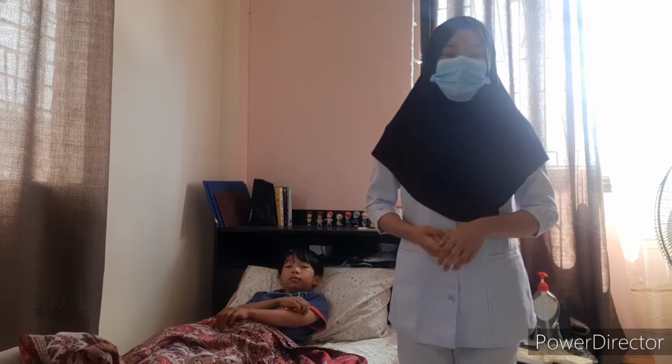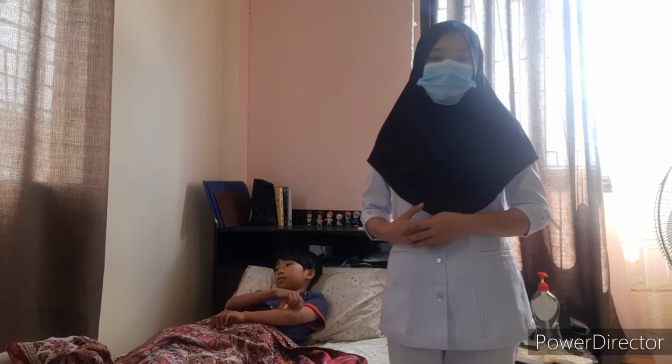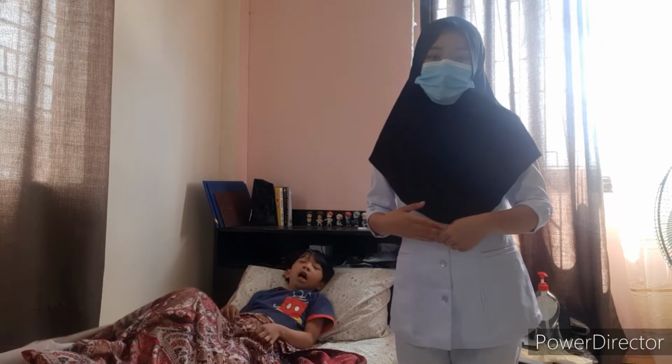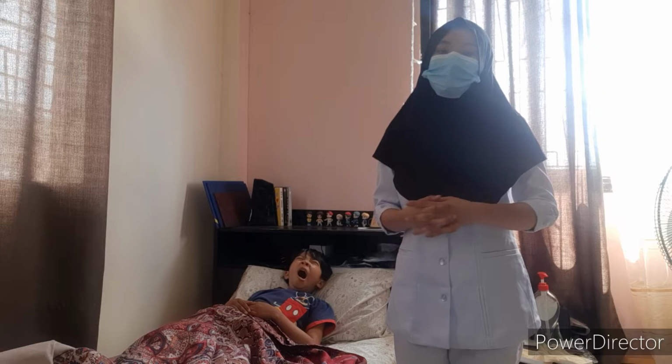So good day. For today's procedure, I'm going to assess the body temperature. Assessing the body temperature is a nursing procedure that provides the baseline data for the subsequent evaluation to determine the changes in the core temperature of the patient and then respond to a specific medical intervention. So the normal body temperature ranges from 36.5 to 37 degrees Celsius.